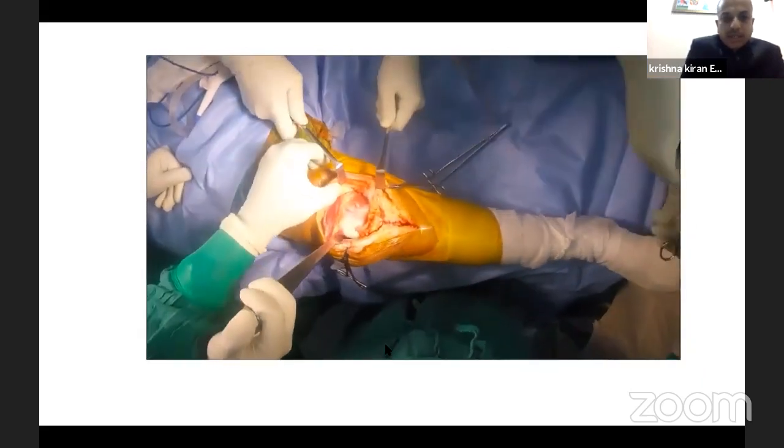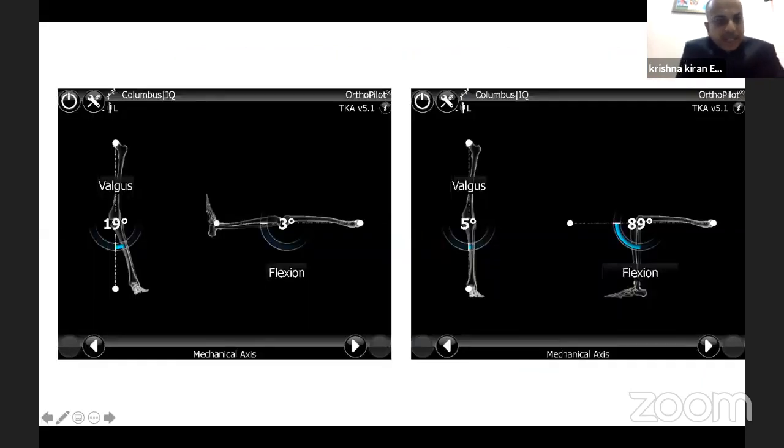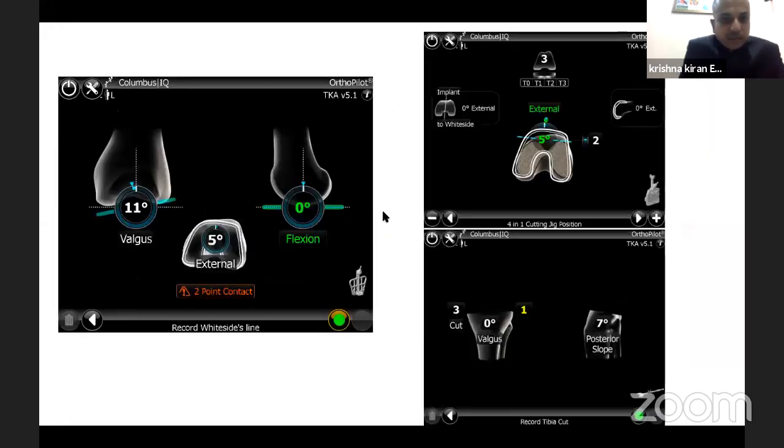So this particular case we did with CAS, we identified that the valgus deformity in extension was around 19 degrees, and at 90 degrees flexion was 5 degrees. So the deformity is not that much in flexion as was previously discussed. The problem is predominantly in the distal femur: 11 degrees of distal femoral valgus as compared to the mechanical axis. And the femoral rotation was set at 5 degrees.